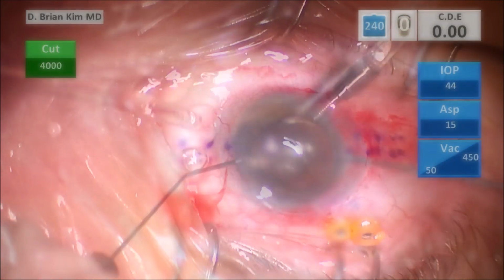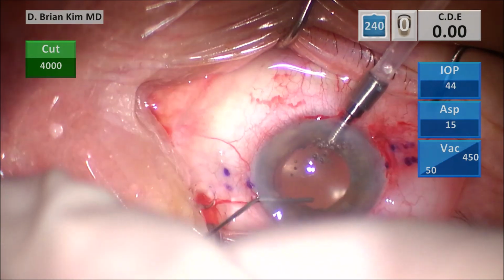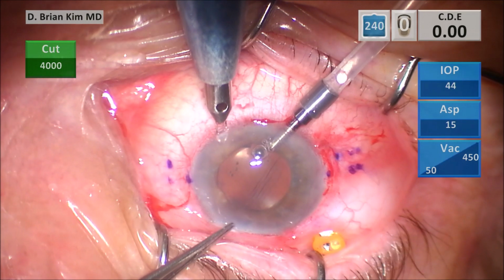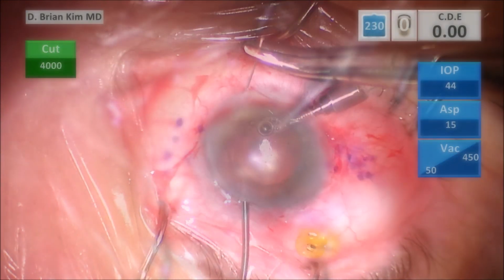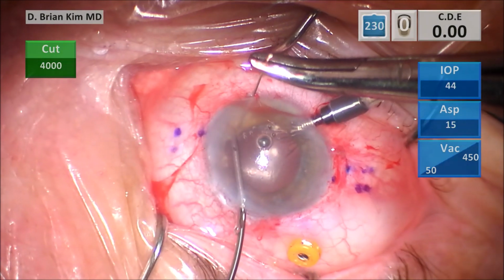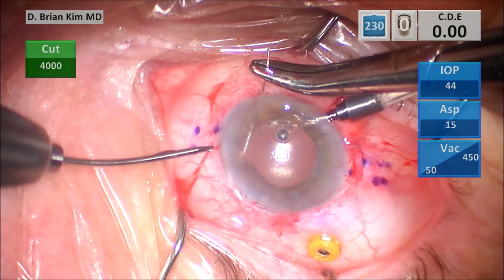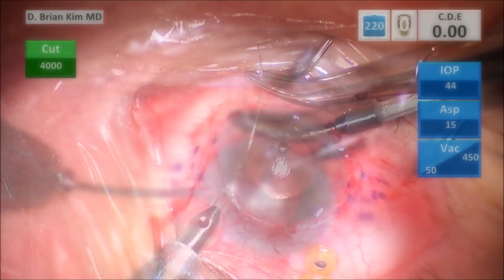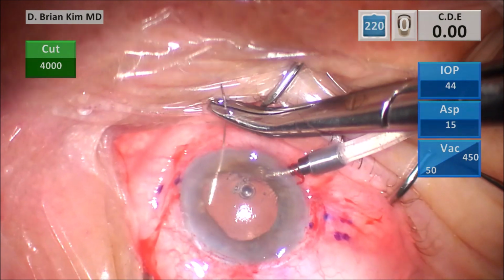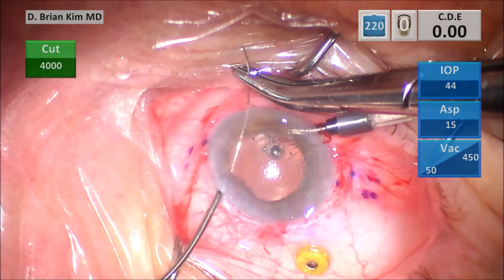I'm pushing some Miochol or Miostat just to see if I can bring the pupil down a little bit more again. And then these are my incisions for the pupilloplasty. You always want to make your incision so that it's going to make it easy to do the pupilloplasty. Don't think, oh, I've got a paracentesis here, why don't I try to use that? It's going to be very, very difficult to perform the pupilloplasty that way. So you need to make the incision strategic to allow yourself to do the pupilloplasty.